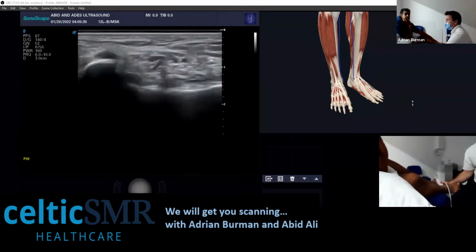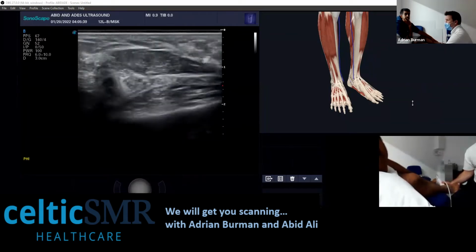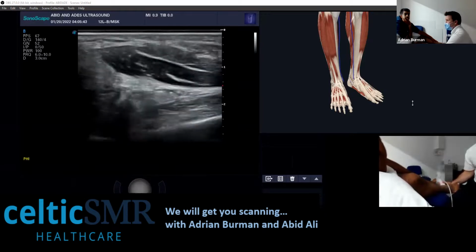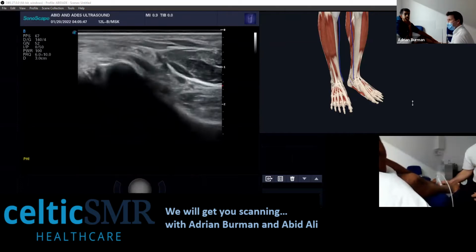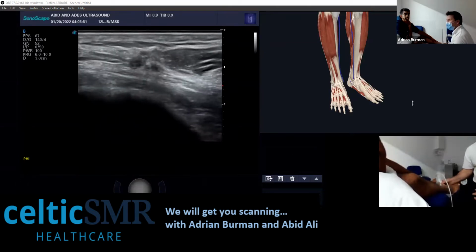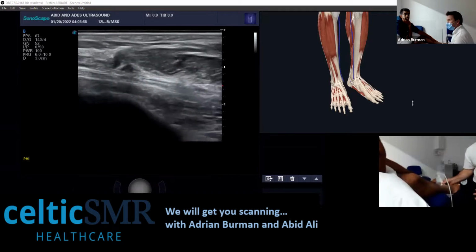Follow the nerve as far as I can. It's difficult to look for really tiny things when you go any further than that. Long section. Just see how the caliber of the nerve changes, if it does at all.